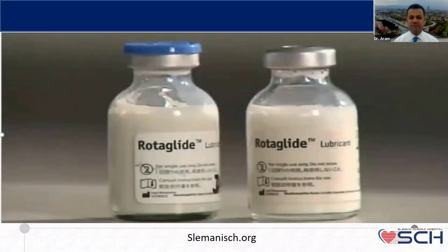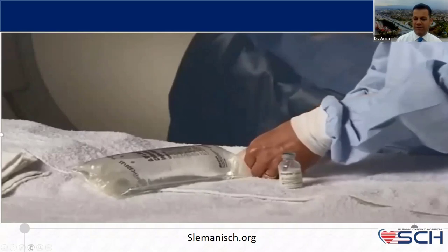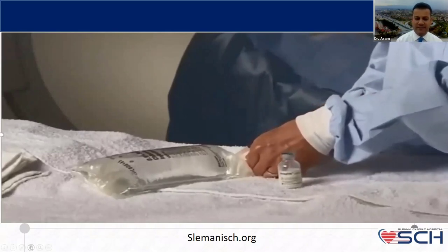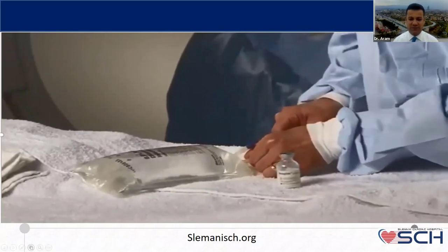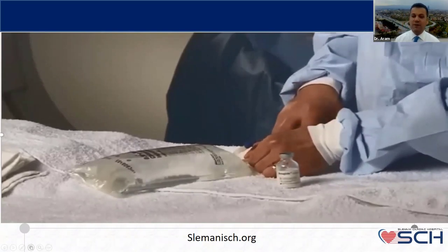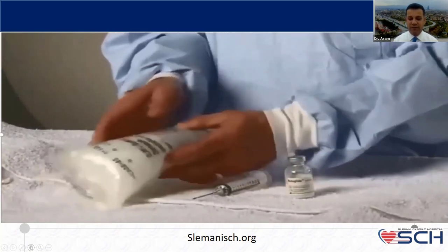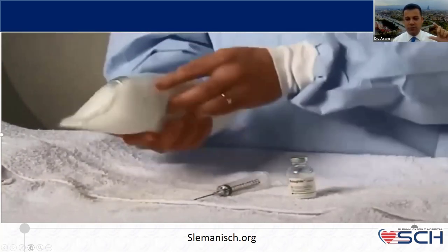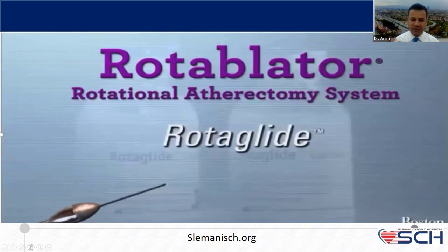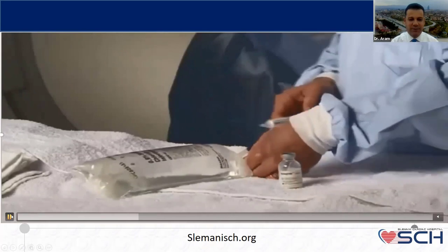After that, this is a Rotaglide. A Rotaglide acts as a lubricant. It contains olive oil and other materials. Personally, to be honest with you, we don't have it in our cath lab and I haven't used it, but if it is available, it's better because it is recommended. You mix one bottle into 1 liter of normal saline, and it will ease your action because it acts as a lubricant.